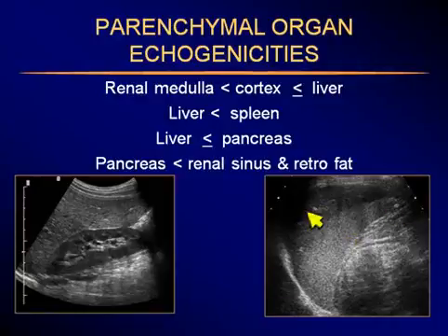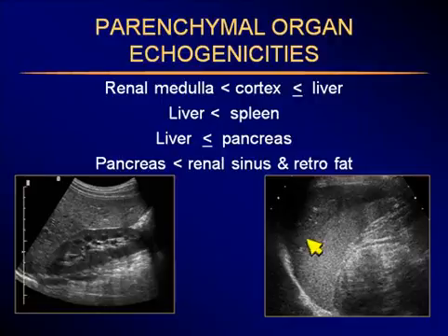And this is not to be mistaken for a subcapsular hematoma. Sometimes this is mistaken in the spleen. So there's our proof.